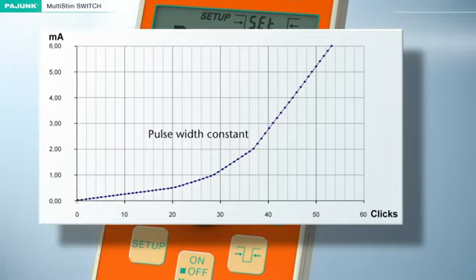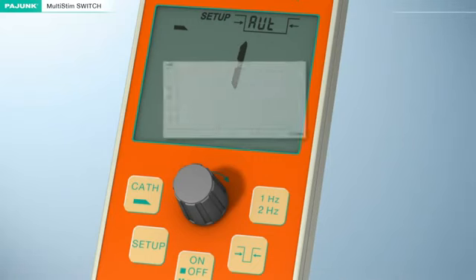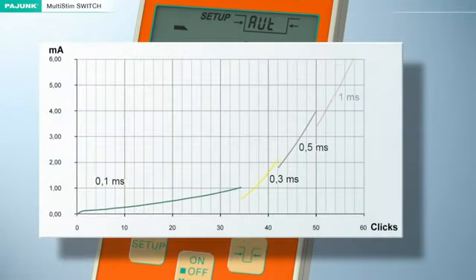Changing the current values is effected in steps. These steps will be correspondingly large at great distances to the nerve, and will become smaller as the cannula approaches the nerve. In the automatic mode, the pulse width depends on the pulse current and has, on the basis of the Choquet-Feugeat table, been stored permanently in the nerve stimulator. The intention of this method is to achieve a fast, efficient approach to the nerve on the basis of a constant charge.